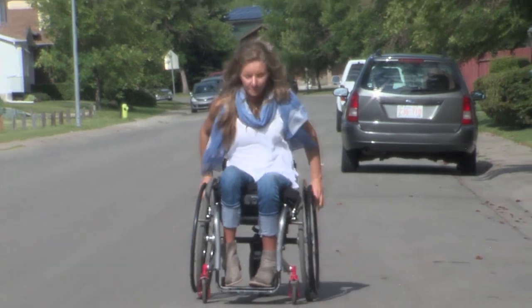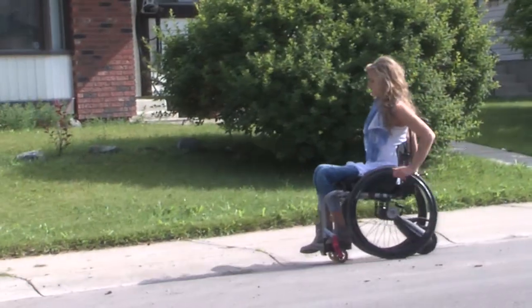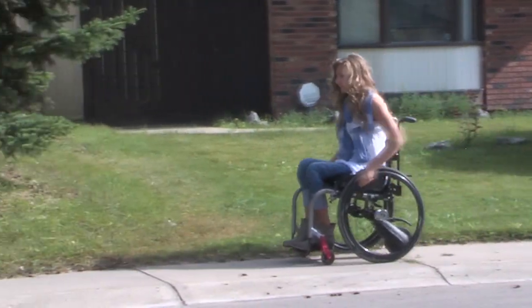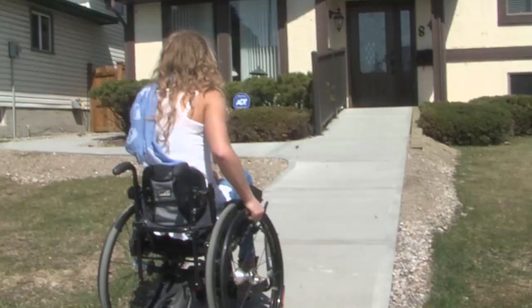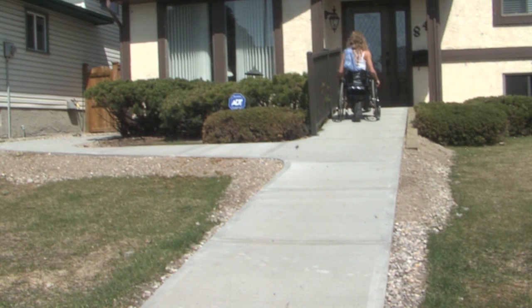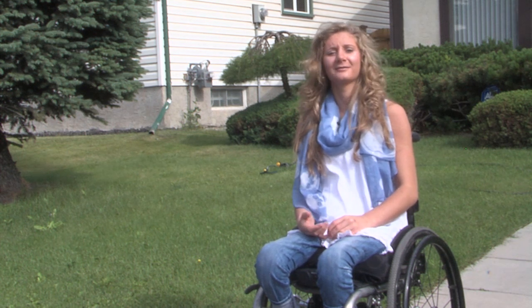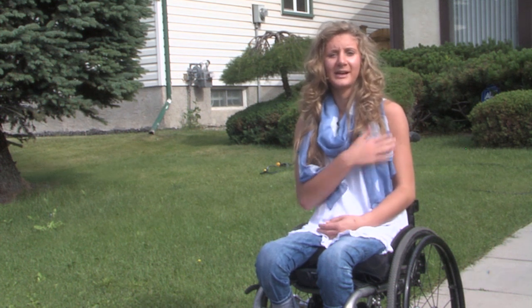For example, I'll push and then it'll just match that speed, so I don't have to use all my energy. One of the reasons I got the SmartDrive was because I didn't want to wear out my shoulders and my rotator cuff — I didn't want to reach my 30s and not be able to play sports or sit ski because my shoulders are shot.